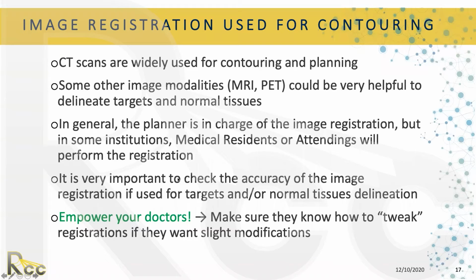For example, in our institution, medical physics does the registration, and if the physician doesn't agree, here it is very important to empower your doctor to know how to tweak the registration in order to make slight modifications. Because this is going to be very important to accurately delineate the targets and the normal tissue.